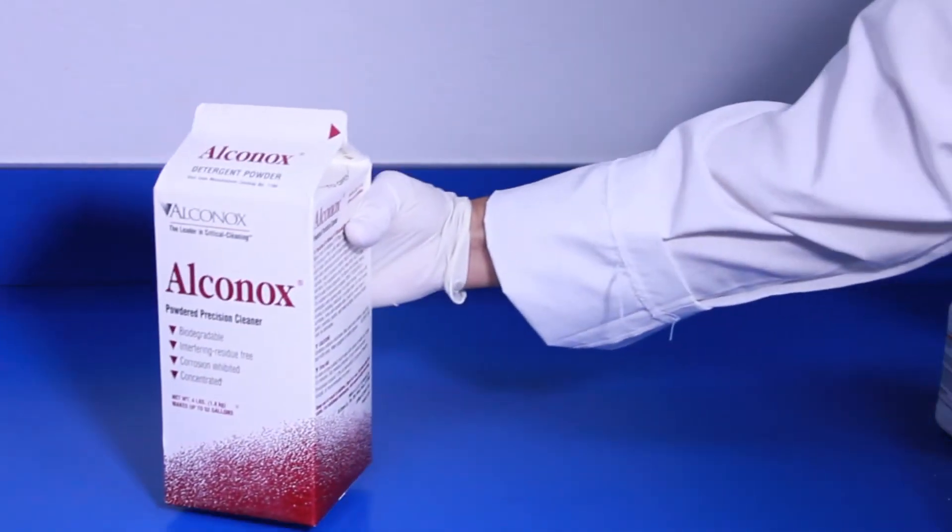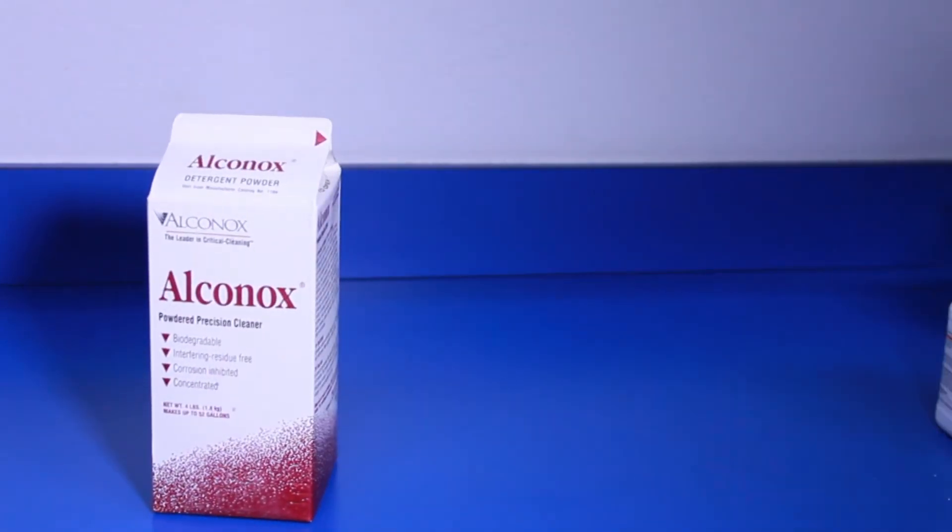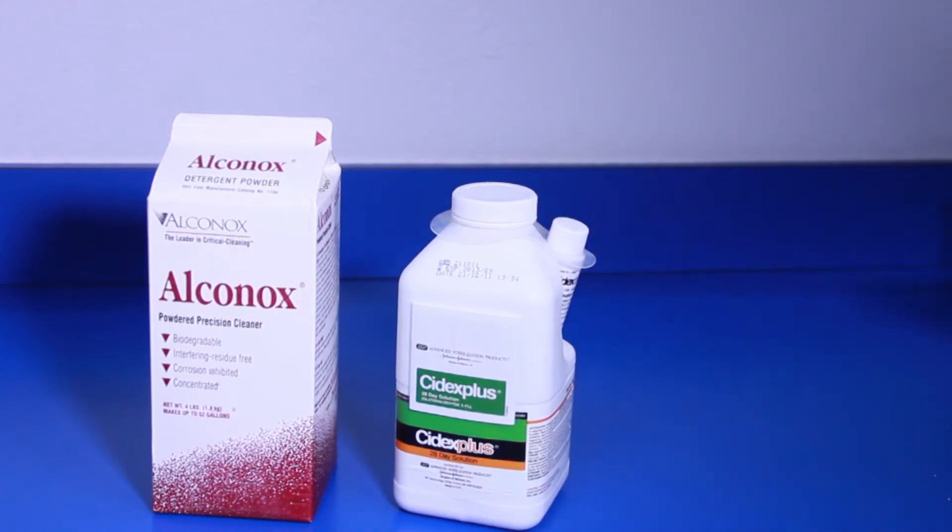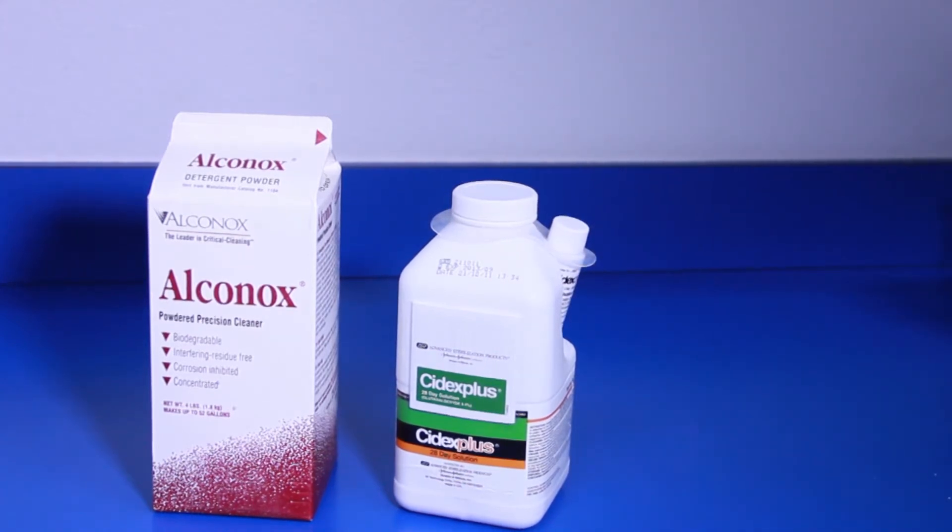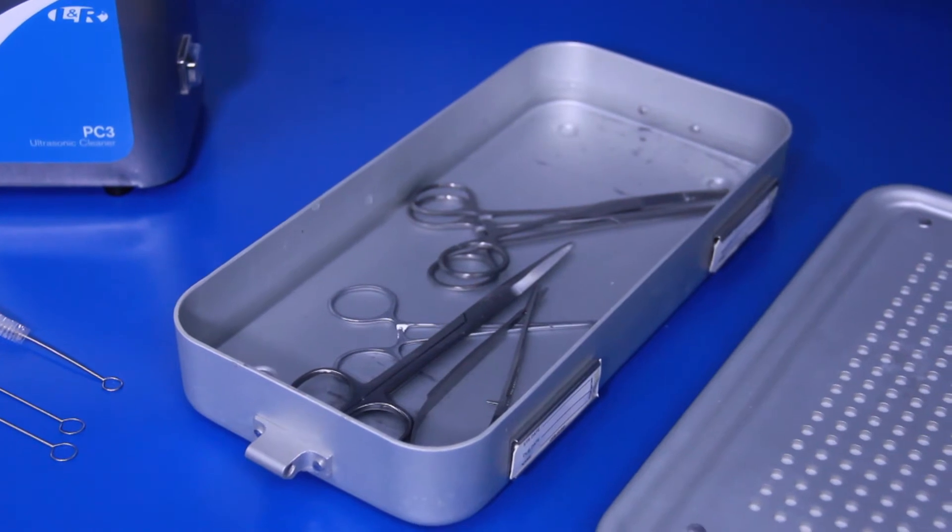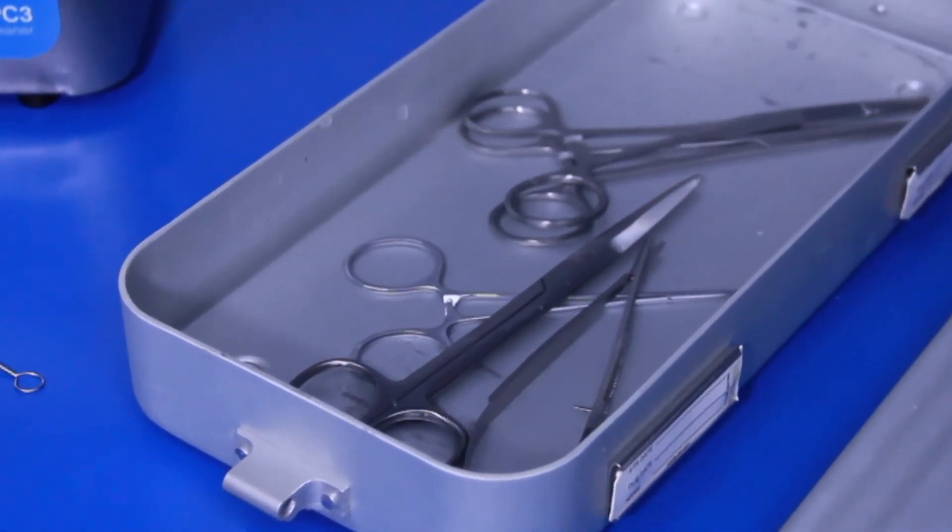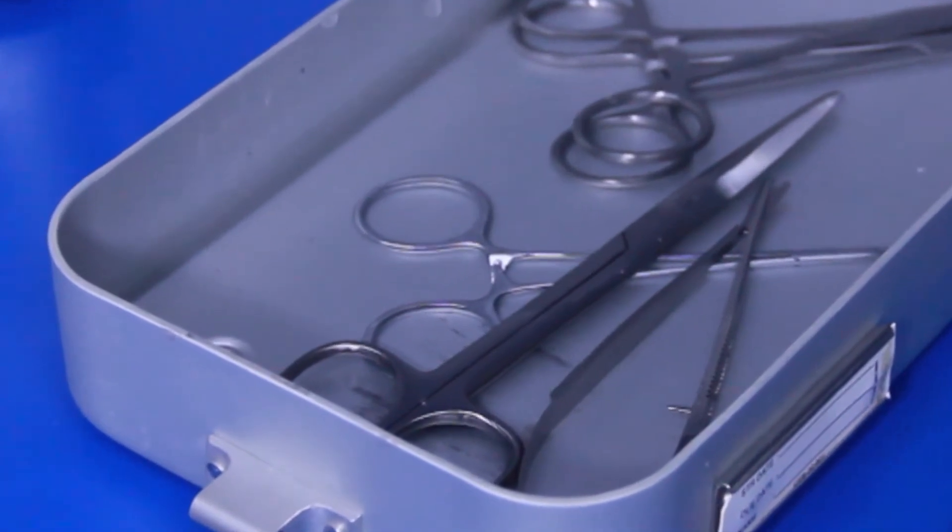Use only neutral pH detergents. If the instruments are not rinsed properly, low pH detergents may break down the stainless protective surface and cause black staining. High pH detergents may cause surface deposits of brown stains, which can interfere with the smooth operation of the instrument.